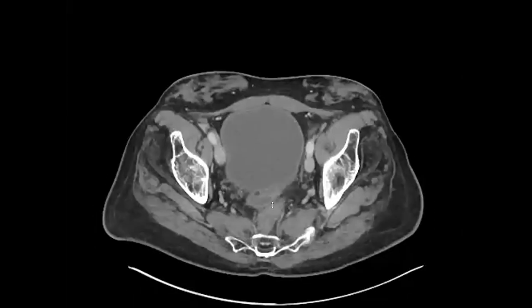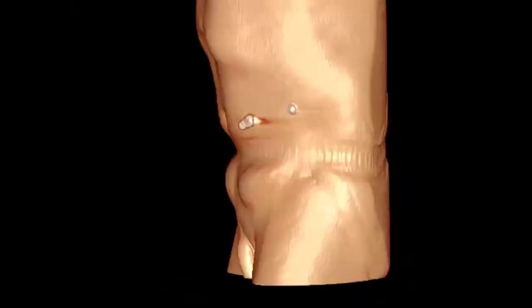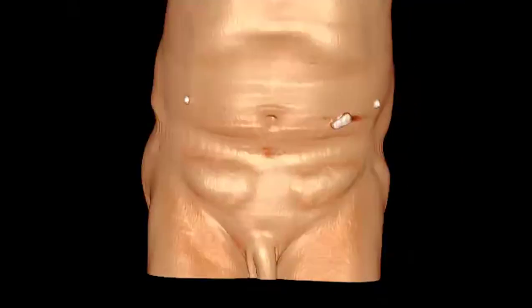So another elderly male patient comes with lipohypertrophy because of insulin injection. Looks like lactating breast tissue. Very nice. Yeah, very extensive. Oh, you have the positive belt sign. And the glucometer. Yeah, continuous CGM. Yeah, that's about it. Thank you.